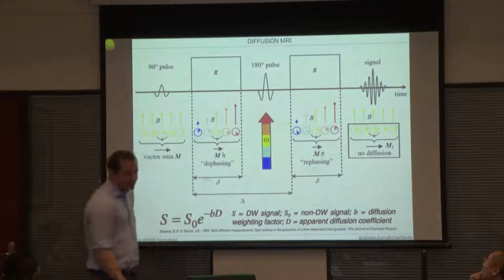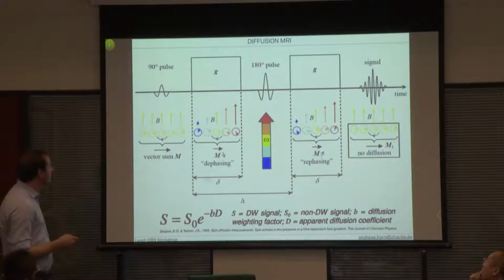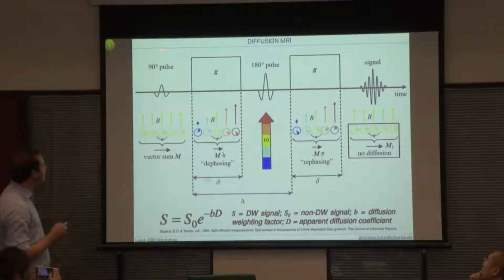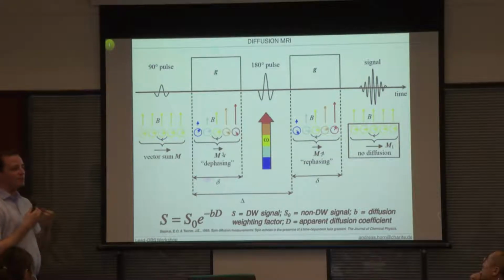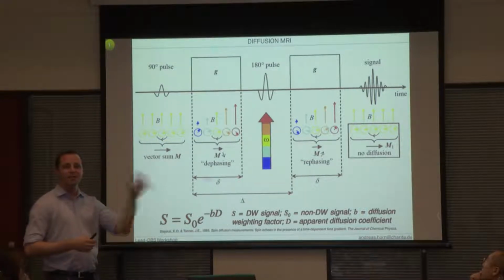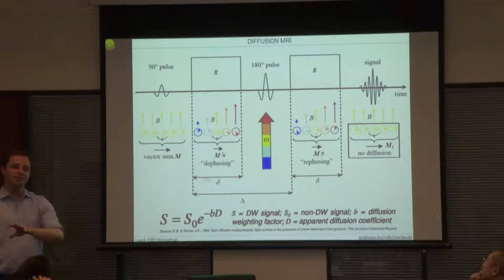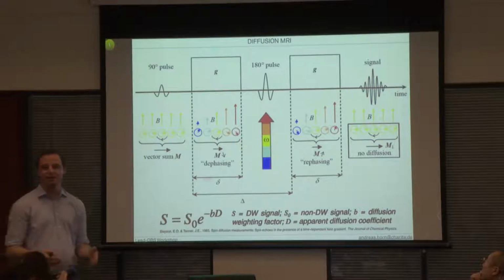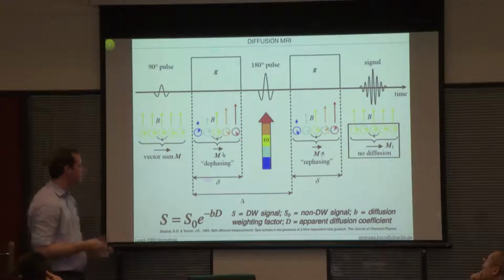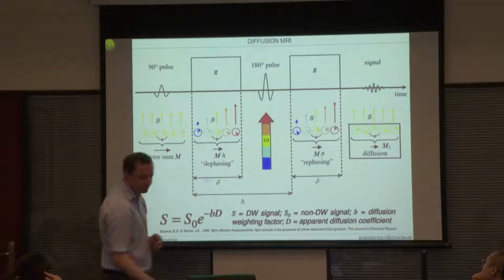And this is a bit technical now, but we actually can measure diffusion. I won't go into details, but we do this by applying two pulses, a 90-degree pulse and then an inversion pulse. So basically you can think about it as taking two pictures. You take the first picture and you tag the water molecules, and then if they diffuse away, if you take the second picture, then you get a signal loss. And so you get a black picture because they diffuse away. So that's basically the idea. So the more they diffuse away, the less signal you get in the end, right?